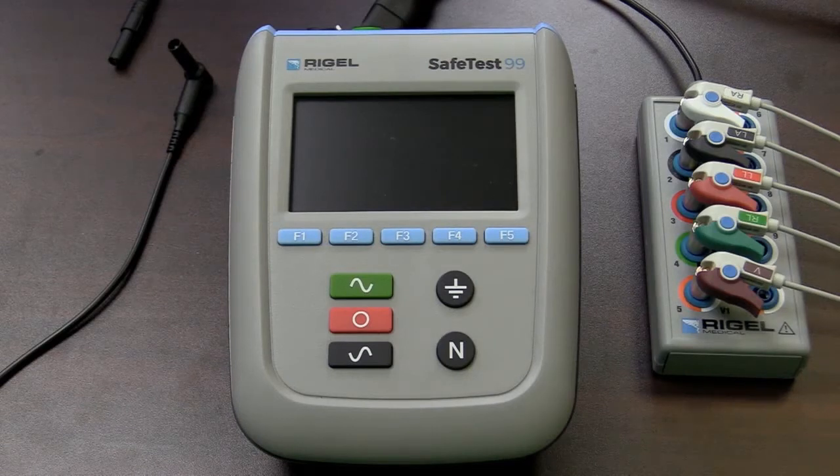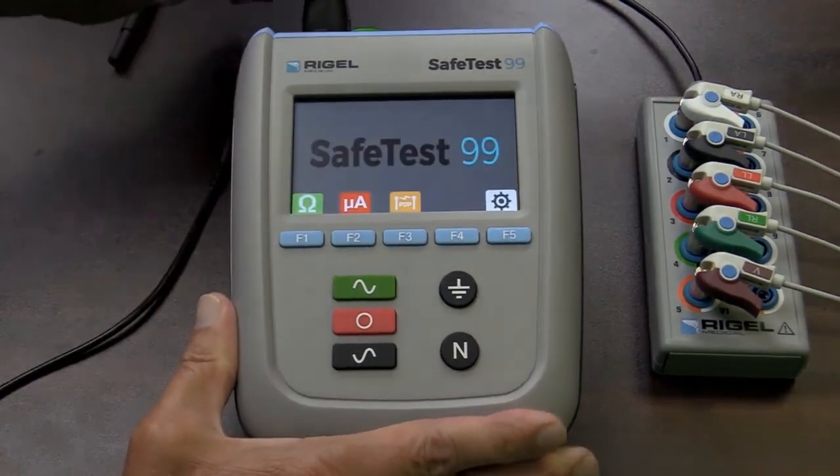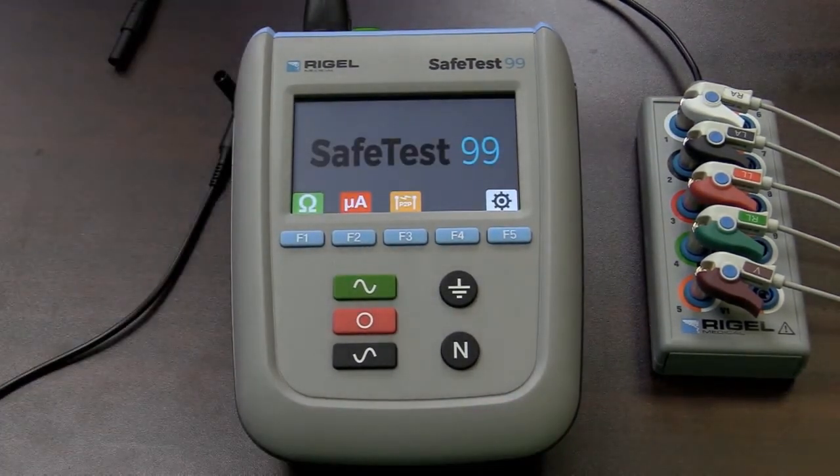Let's take a look at the operating keys of the SafeTest 99. I'm going to connect the power cord to the unit, and you see how quickly the SafeTest 99 powers up. Now this is the home screen, and above F1 — the five soft keys — F1 is the ohm symbol, and that is where we'll do our ground continuity testing.